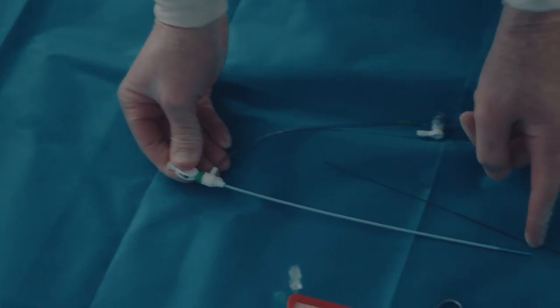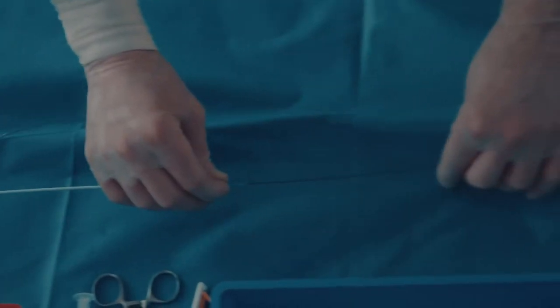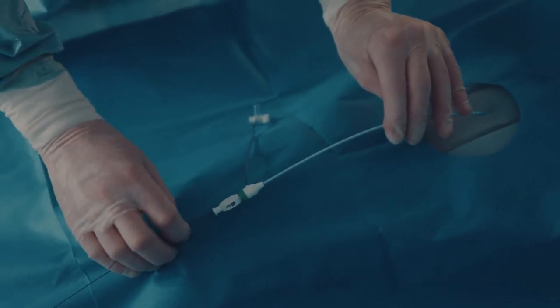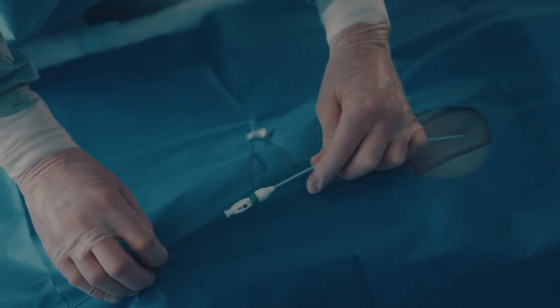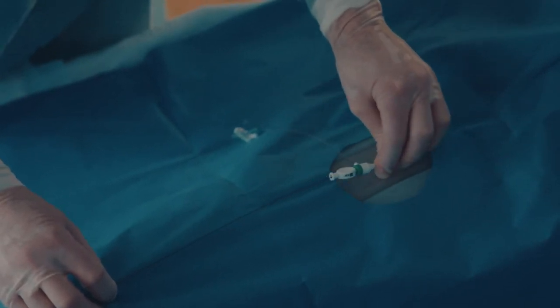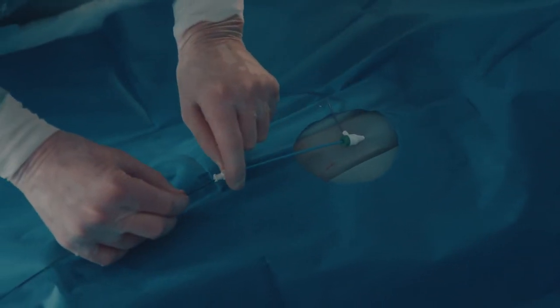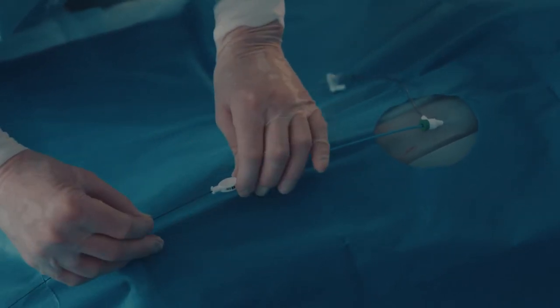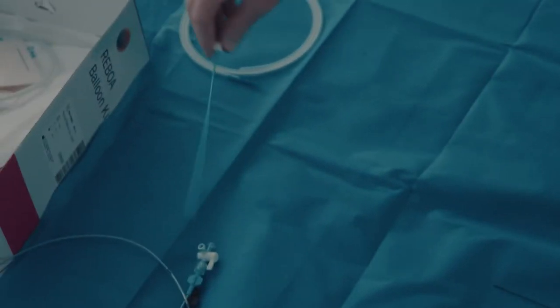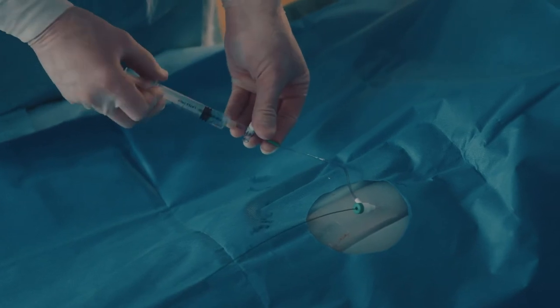Make sure that the dilator of the introducer is securely fastened. The click is heard and felt as the dilator is fastened to the introducer hub. Insert the introducer over the guide wire. Make sure that the dilator stays fastened inside the introducer until the introducer hub gets in contact with the skin. Then remove the dilator over the wire.